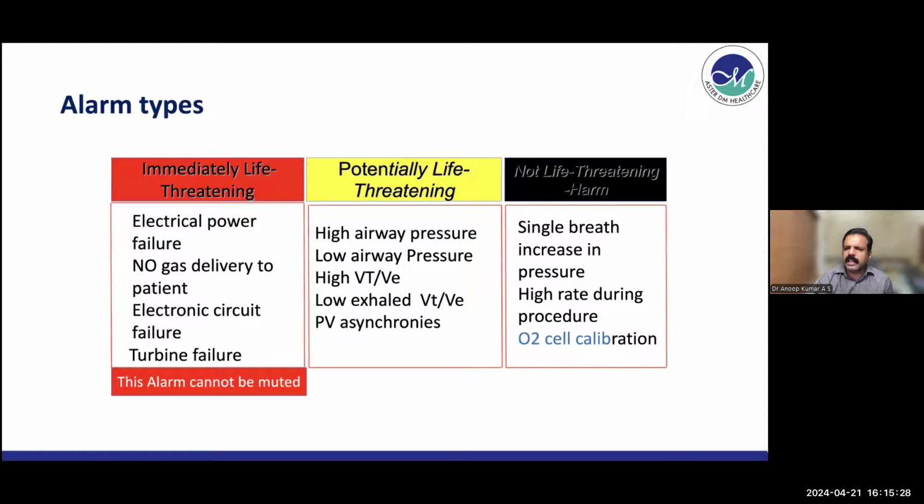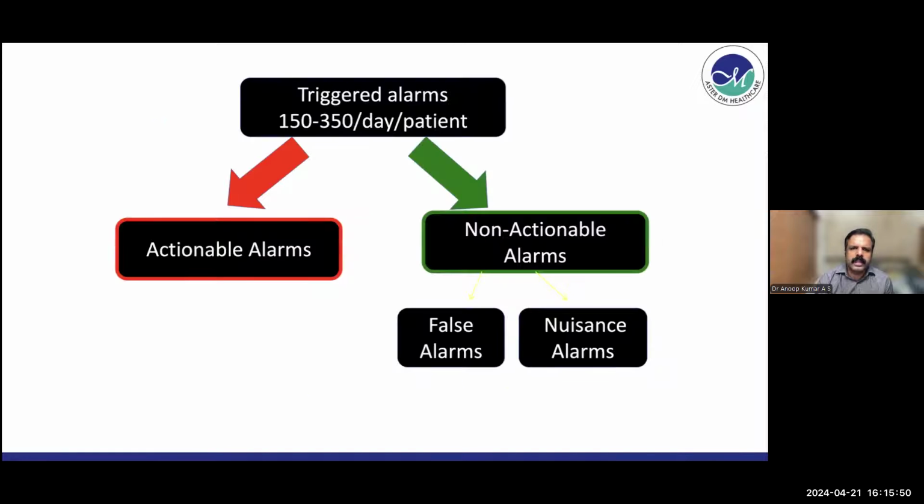And there are non-life-threatening alarms like a single breath increase in pressure, high rate during a procedure, oxygen cell calibration, etc., which are not that important. So you should be well aware of these life-threatening and potentially life-threatening alarms and how to tackle them.